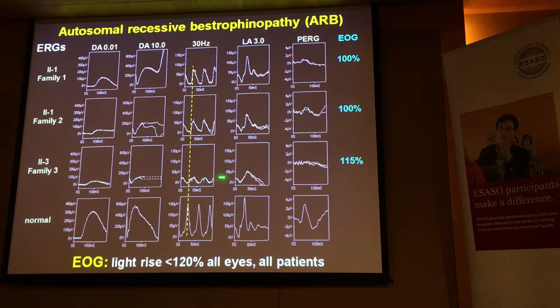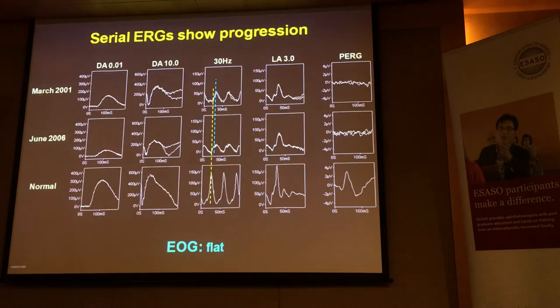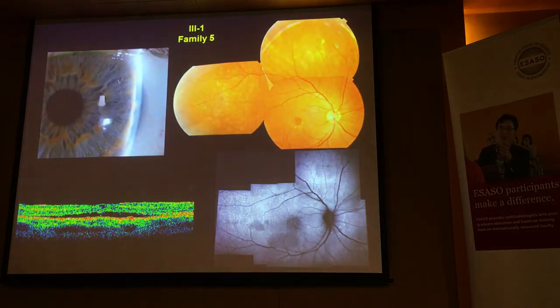These are progressively more severe retinal disease, but they've all got ERG abnormalities. It's progressive, you can get scar formation, peripapillary atrophy here, and this is a patient between 2001 and 2006, showing increasing delay in the flicker ERG and progressive loss of rod photoreceptor function. They can also get closed angles, they can get glaucoma, that's not uncommon. They often have subretinal fluid. But again, this sort of patchy, odd sort of fleck lesions, which aren't really flecks. They all have the same indistinct pattern of abnormality.